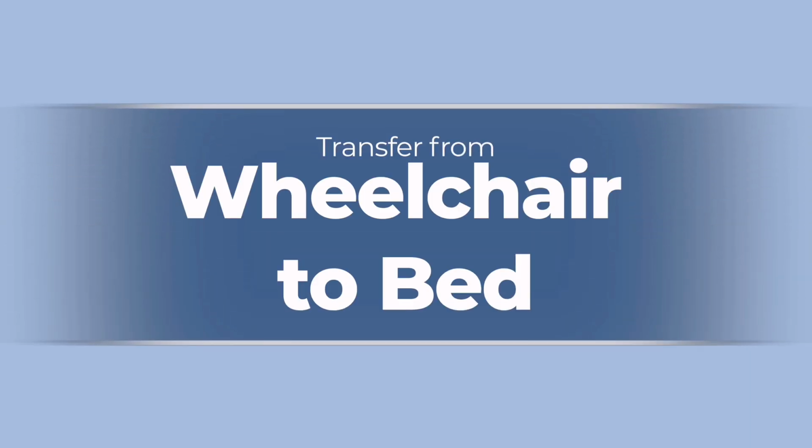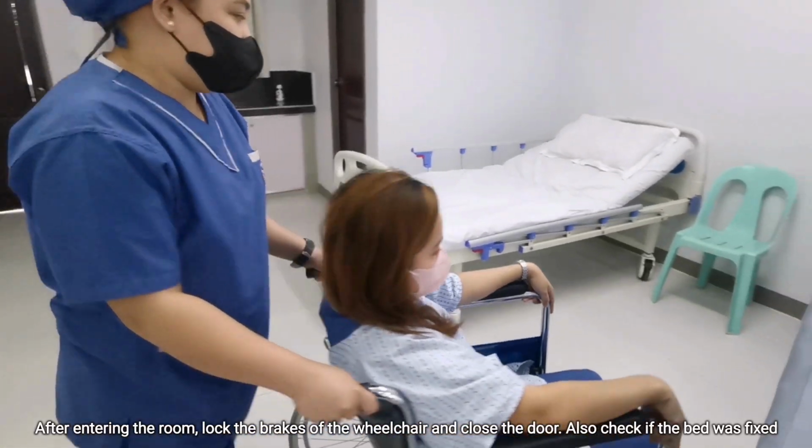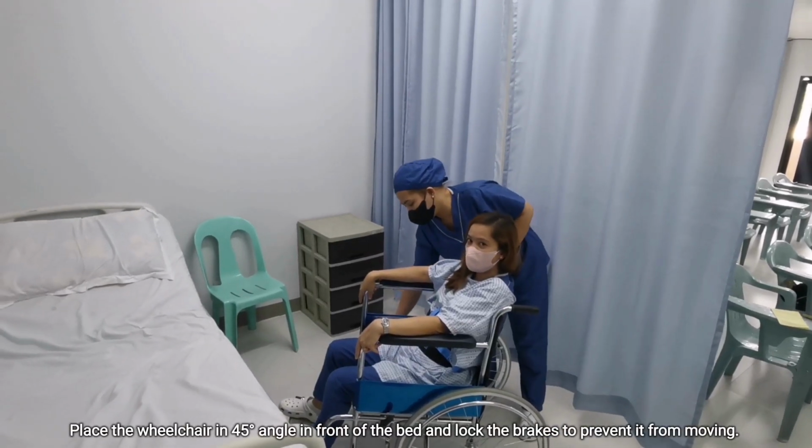Transfer from wheelchair to bed. After entering the room, lock the brakes of the wheelchair and close the door. Also check if the bed was fixed. Place the wheelchair at a 45 degree angle in front of the bed and lock the brakes to prevent it from moving.